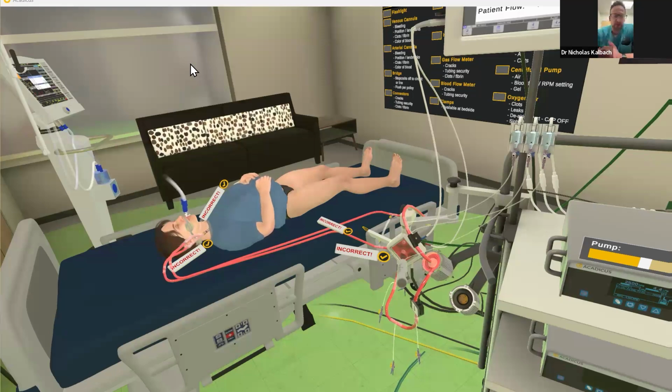So from that actual cannulation site, you can see the blood. Right now, it looks like we might be recirculating, which is a common phenomenon that we see, where because you have this cannula occupying the same vessel that you are both draining and returning to, sometimes those drainages can happen at the same time. Essentially you are draining from the return blood. So you can look like you are draining oxygenated blood from the patient. Sometimes that can be acceptable, and other times that is an issue that we can actually simulate in this.